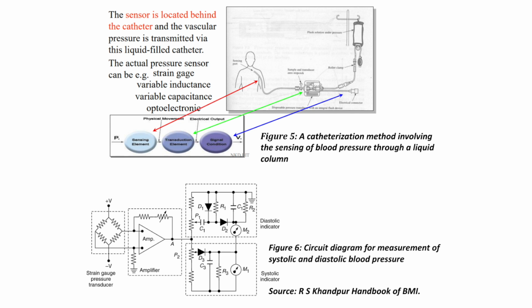The excitation for the transducer comes from an amplitude controlled bridge oscillator through an isolating transformer which provides an interconnection between the floating and grounded circuits. An additional secondary winding in the transformer is used to obtain isolated power supply for the floating circuits.